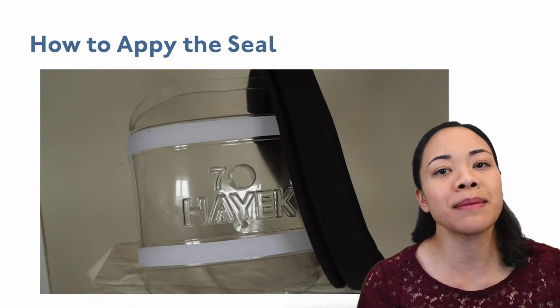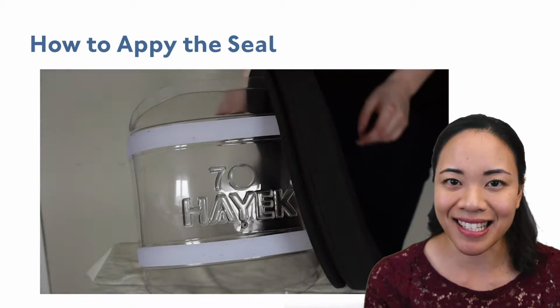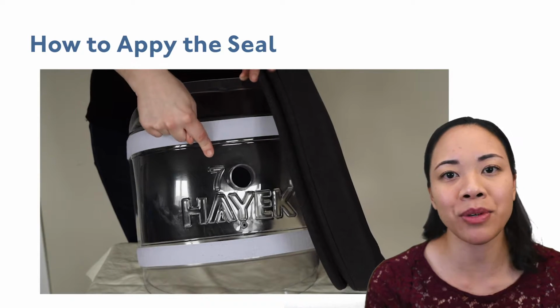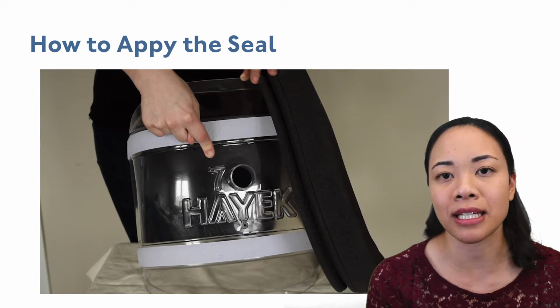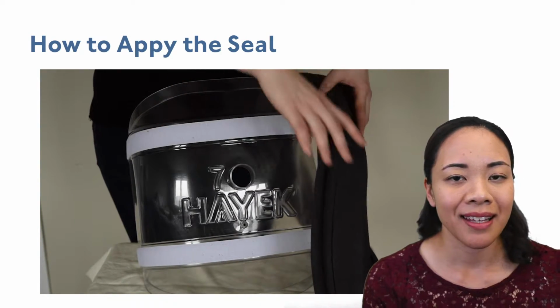Now we come to seemingly the most challenging part of putting the Cuirass together: applying the seal. We've worked with many respiratory therapists, and it seems applying the seal has been noted to not be as easy as it seems.